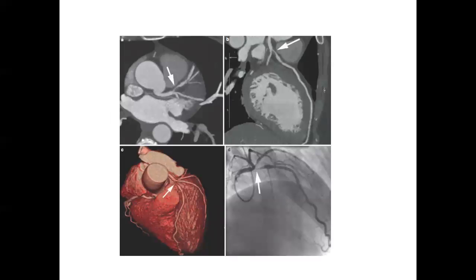If I see a problem, then I go to MPR and look at that segment. So this is the axial slice. This is your MIP, so you can see it looks like a nice, easy to visualize picture. You see a plaque there. Stenosis, actually you can see plaque around it. I don't know if it projects nicely back. This is a curved MIP, when you've laid out the coronary in its entirety.